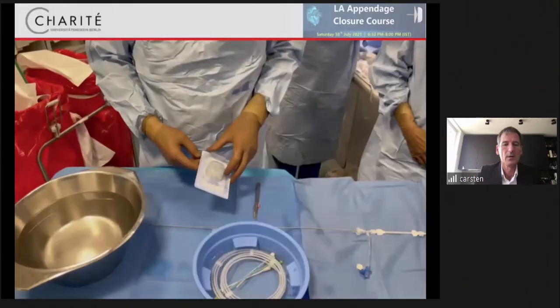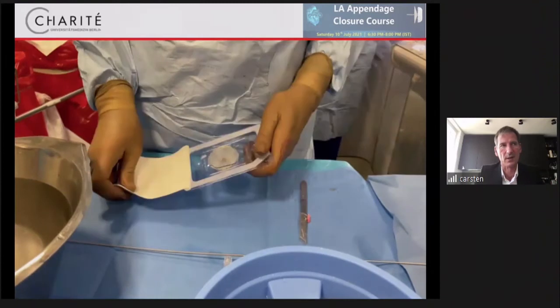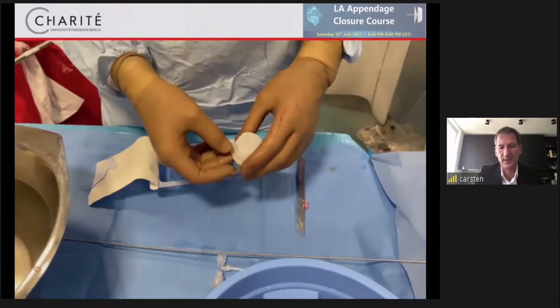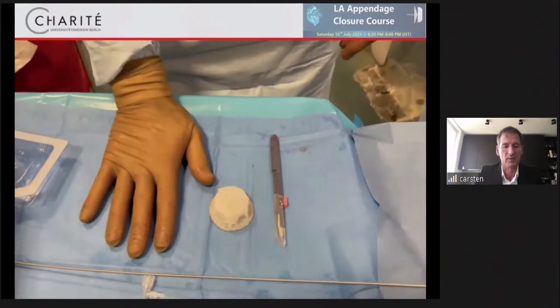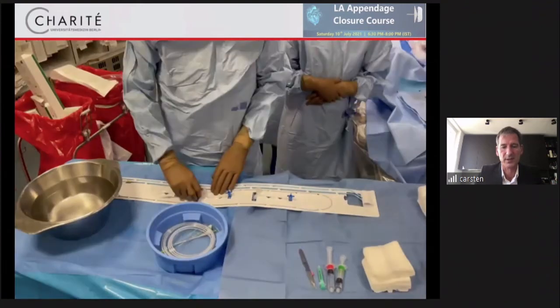So then this is the custom-built option. I can tell you it's a 40 by 52 millimeter Lambre device. I have big hands, and that's why I put a scalpel there. So this is a big device that now has to be assembled, which is pretty easy.